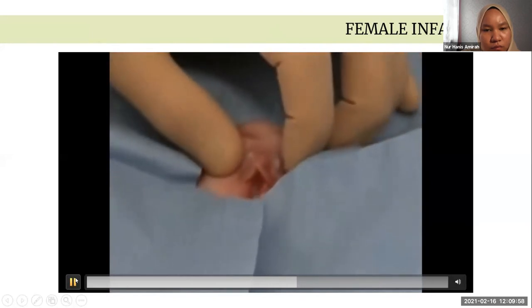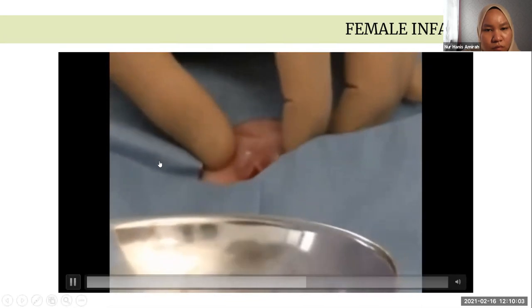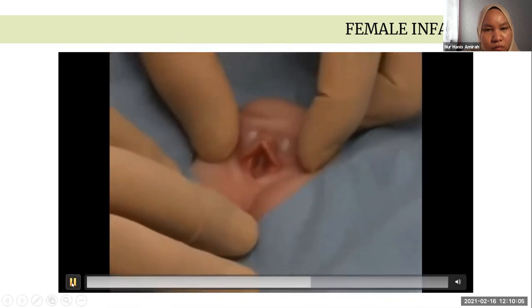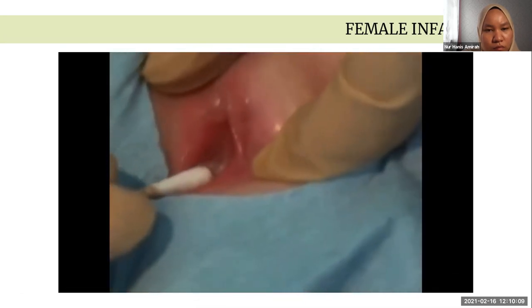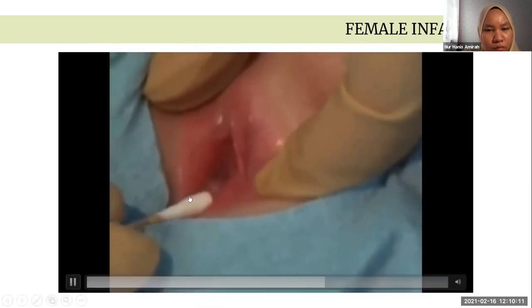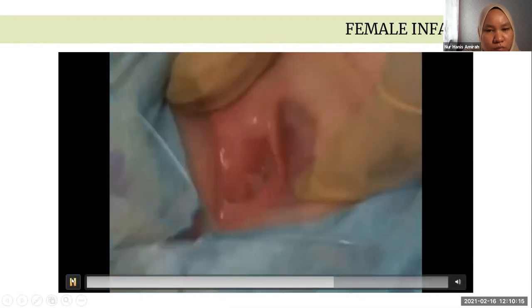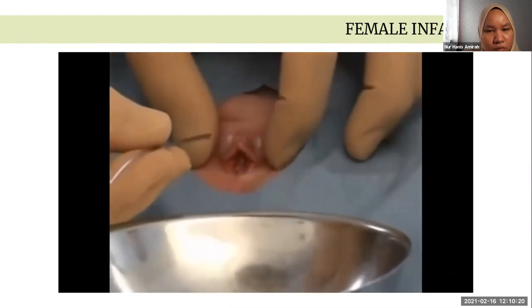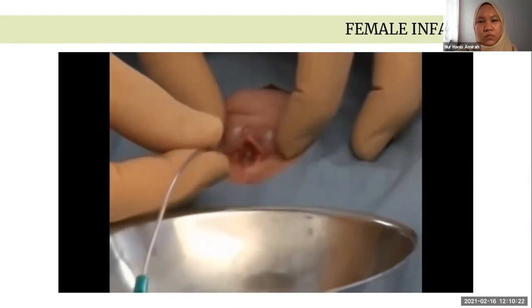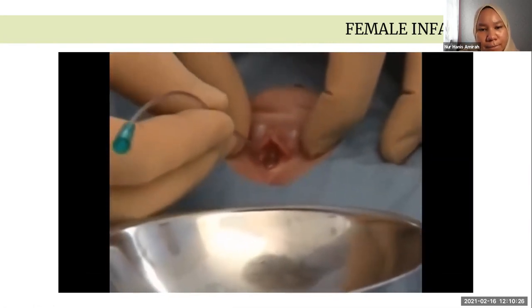Place the catheter in a sterile container within the sterile field between the patient's legs. While holding the labia with your non-dominant hand, locate the meatus. If the mucosal covering of the vagina makes this difficult, gently pull the cephalad fold of the vaginal introitus downward. Once you have located the urethra, hold the lubricated catheter with the fingers of your dominant hand, then slowly and gently insert the tip of the catheter into the meatus.